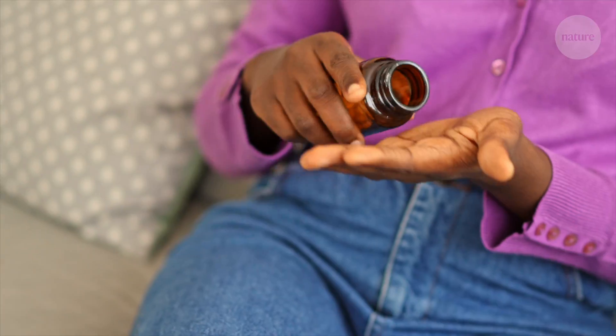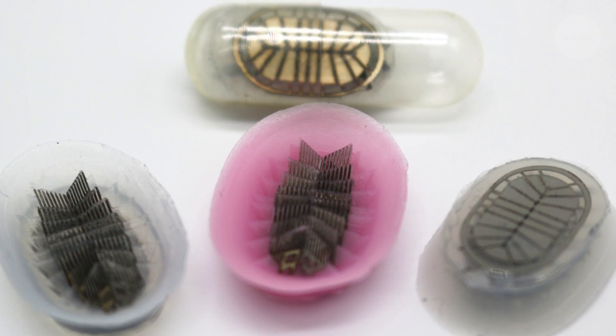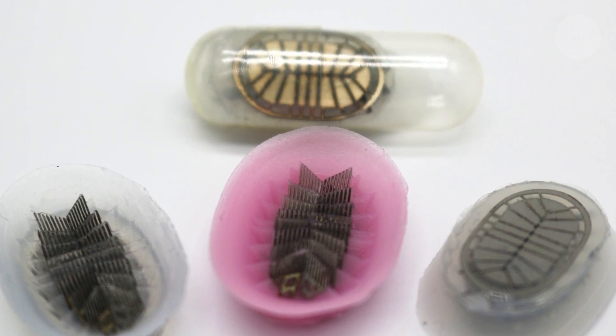A device that sits in the gastrointestinal tract for an extended period could be ideal for delivering medicine, especially medicines that need to be taken regularly over a long time. Over 50% of people fail to take medication as prescribed. But if we're able to make it easier — such that someone could take a medication once a week or once a month — that's associated with higher adherence or compliance rates. A patient could swallow a device like this in a small capsule, which would dissolve in the stomach or intestines so that the device was free to attach to the walls.